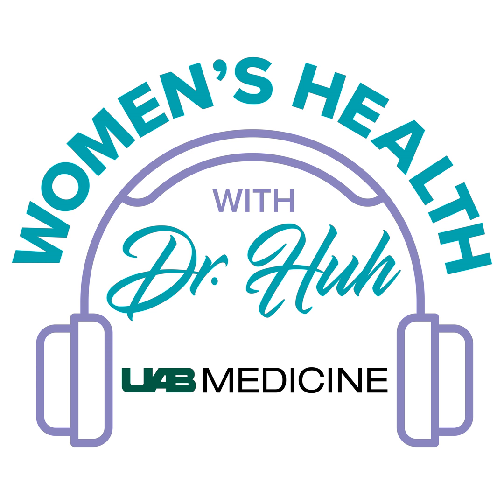Finally, we bring a needle tip into the abdomen under visualization, so again, safety is our first priority, and we insert it into the actual fibroid, and using radiofrequency energy, we heat the fibroid, which denatures it. And the best way to describe that is fibroids are usually hard and appear to be very similar to almost like a baseball or softball, depending on their size.